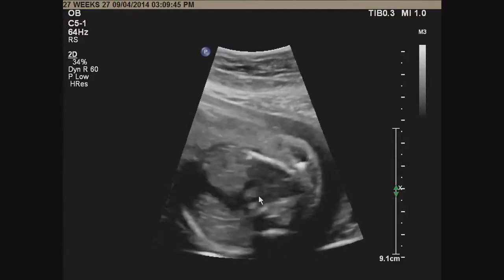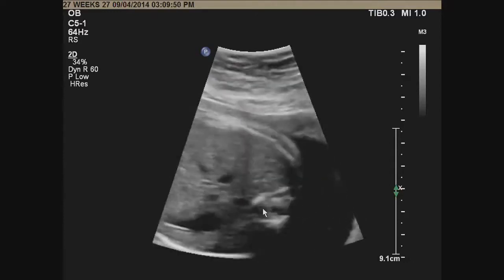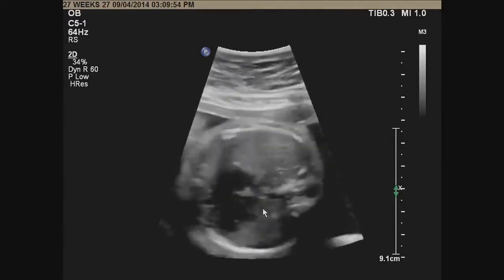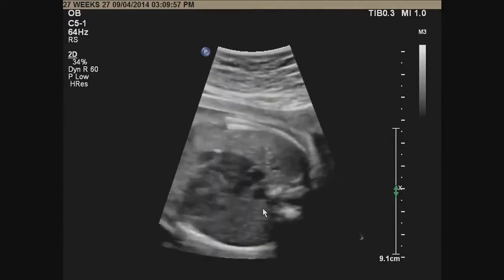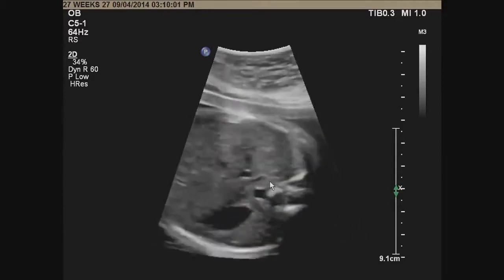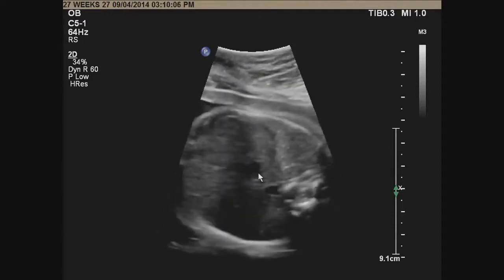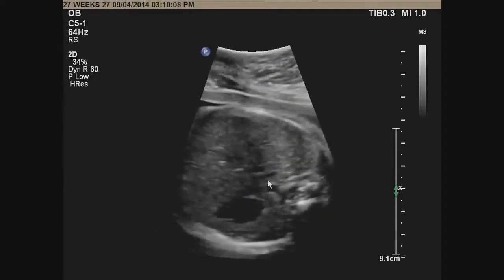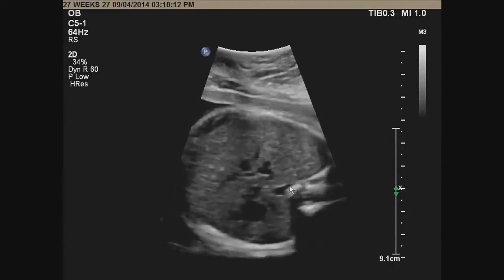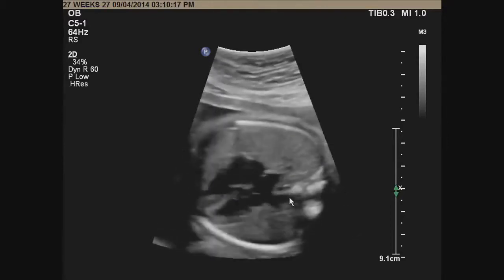You can actually see it from the first trimester if you look for it. The key is it has to be certainly smaller than the aorta. Normally, it's about 1/3 the size of the aorta. When you start seeing a large vessel sitting next to the aorta here, then you have to be very suspicious that there's an interruption of the inferior vena cava. Typically, the interruption is suprarenal. And then there is an azygous continuity, where the systemic venous system is coming up through the azygous vein and dumping into the superior vena cava, most commonly at the level of the heart.